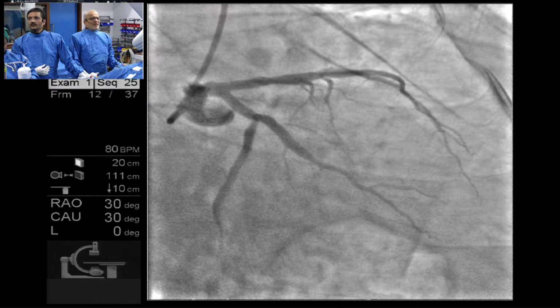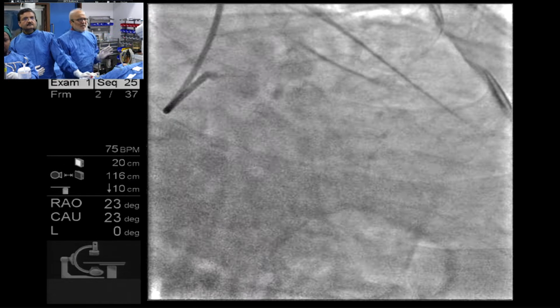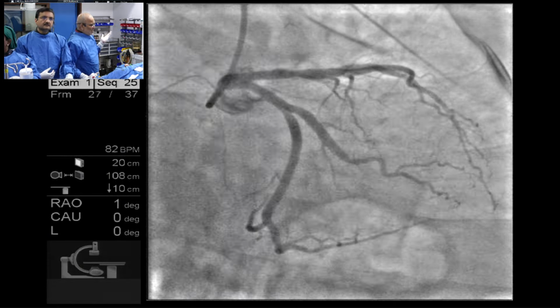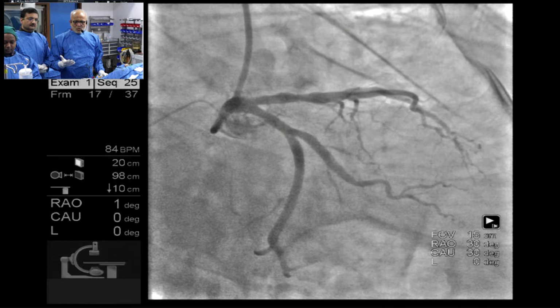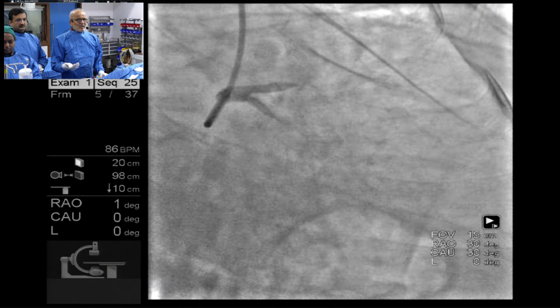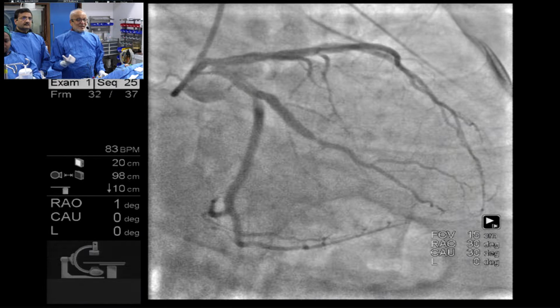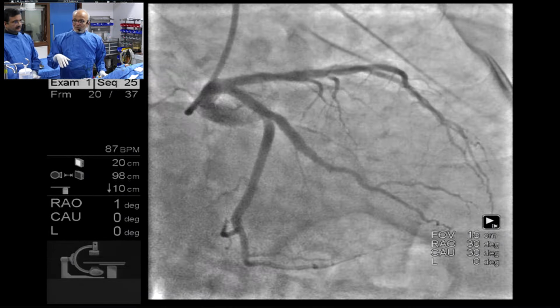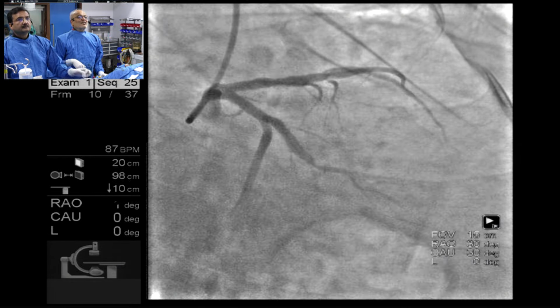So I think there is a regular RCA lesion, and we are nearing 130, and we can go. If you want, we can go off live and conclude here. Sure. We have 3 more cases to go. The FFR case, unfortunately, is in the other lab. I would have loved to do FFR and discuss it, but I think we have to keep it for the next time.